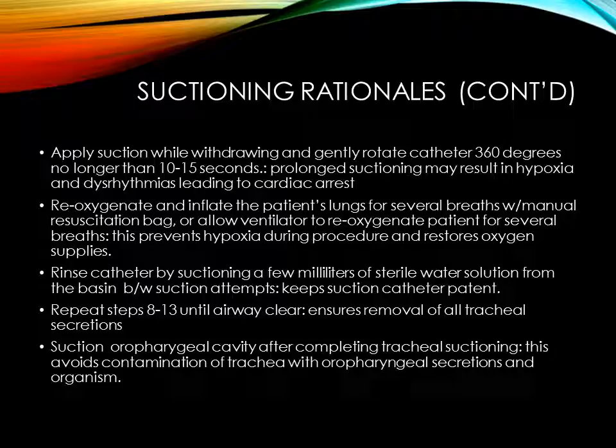Reoxygenate the patient and inflate the lungs for several breaths with manual resuscitation bag, or allow the ventilator to reoxygenate the patient for several breaths. This prevents hypoxia during procedure and restores oxygen supply. Rinse catheter by suctioning a few milliliters of sterile water solution from the basin between suction attempts. Keep suction catheter patent.